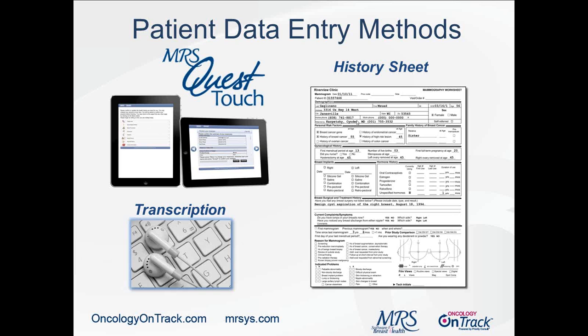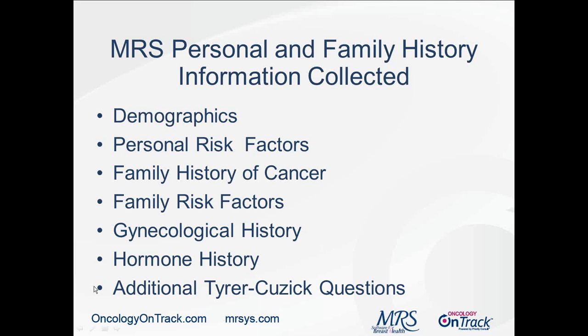Or the facility may use a paper history sheet where information in this example is pre-populated, and all the patient needs to do is make corrections. But now there needs to be a manual transfer of this information from the history sheet into the MRS system, either by transcription, data entry maybe, or maybe even the technologist might be the person to transfer that information. Or the technologist might perform a personal interview with that patient and enter her history at the time of the interview.